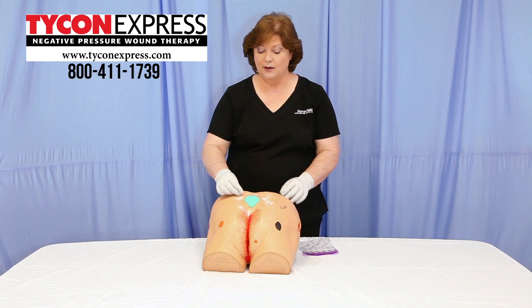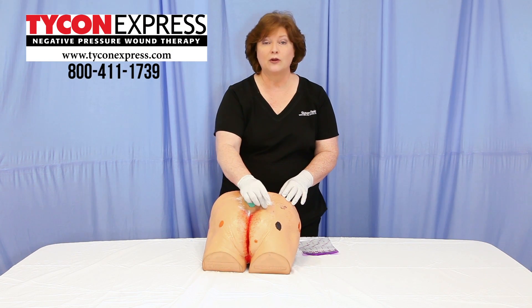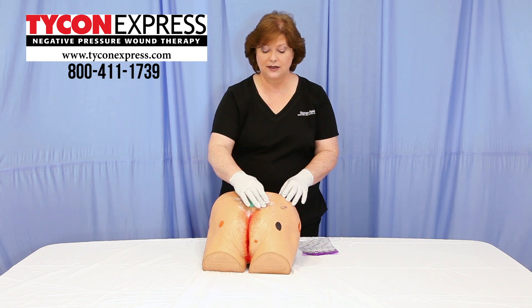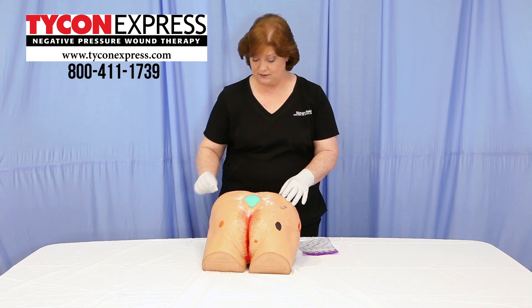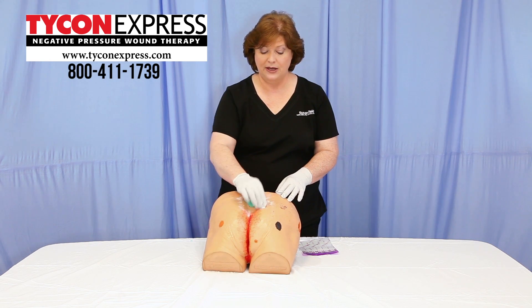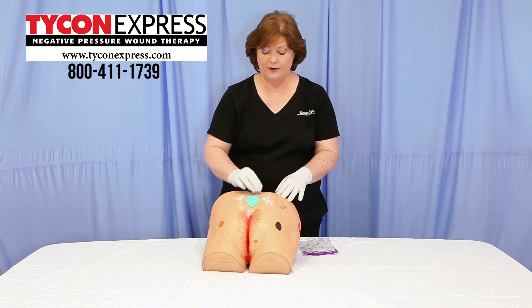Apply another layer of the powder — this can be repeated up to three layers. Again, take the skin barrier prep and dab over the stoma adhesive powder.